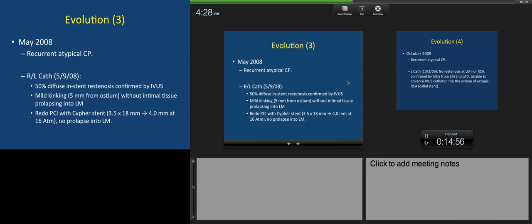This was reassuring and worrying. It was an integral part of the coronary artery that was not covered by the stent, the original stent. Early after the origin, there was a curve around.